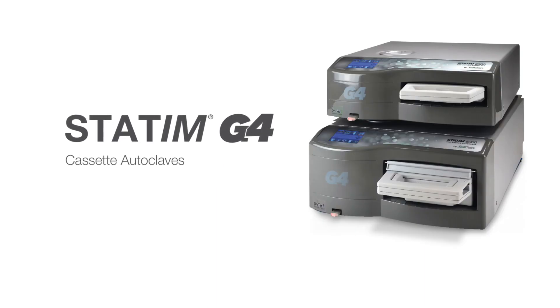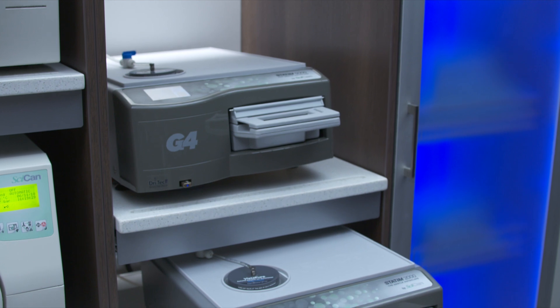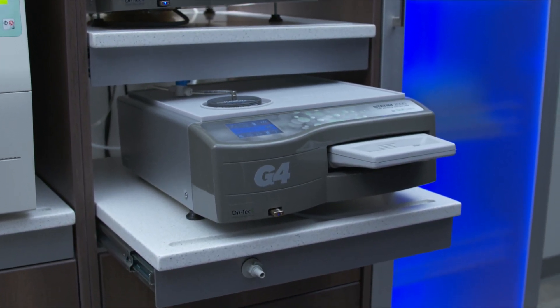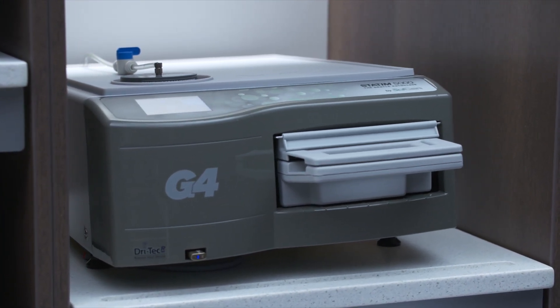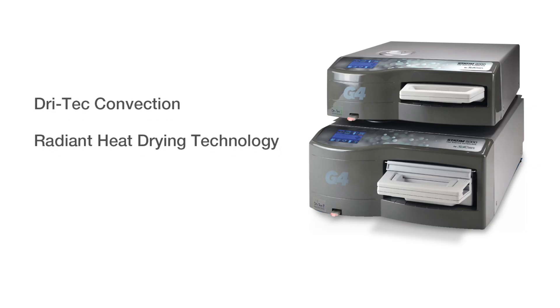Congratulations on your purchase of the STATIM G4. The STATIM G4 is an innovative tabletop cassette autoclave that uses dynamic air removal technology, also known as steam flush pressure pulse technology, to remove air and effectively sterilize instruments. Not only does the STATIM G4 unit have rapid sterilization, but with the Dri-Tec convection and radiant heat drying technology, it also enables rapid drying.